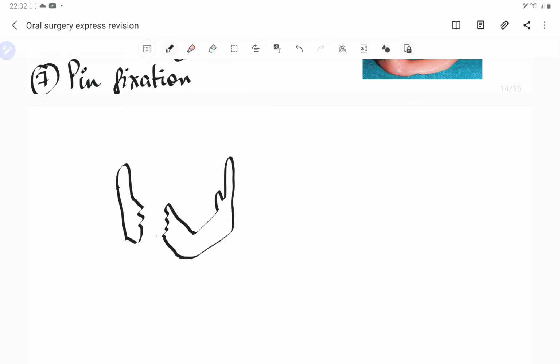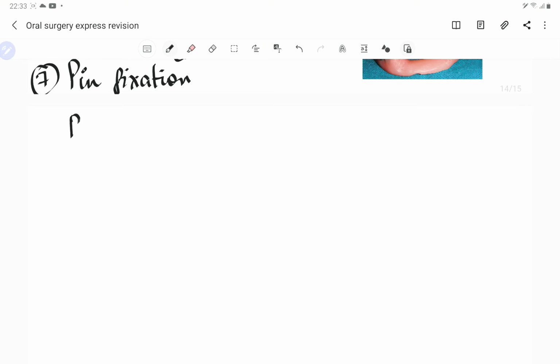So in today's video, we will be covering the internal fixation, basically the fixation wherein we are going to put plates or screws, doing the surgery, exposing the bone and then putting the plates or the screws. So that is the fixation. So we have got some principles of fixations that we will be covering in today's part. So first of all, we will be covering the internal fixation.